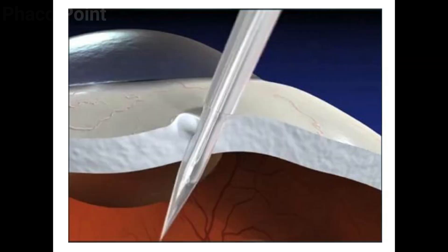Let us now look at the orientation while the trocar cannula system makes its entry. You need an angle of about 30 degrees with the surface at the point of entry. Once engaged, the direction is turned so as to make the trocar cannula system perpendicular to the globe and directed towards the imaginary optic nerve head.